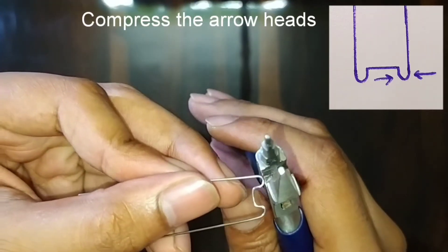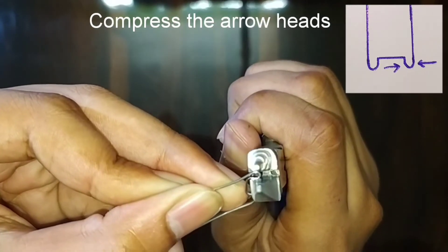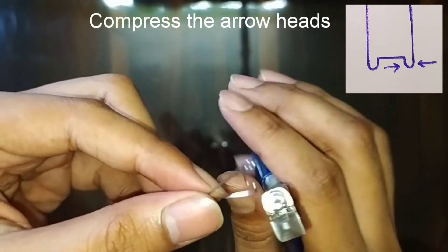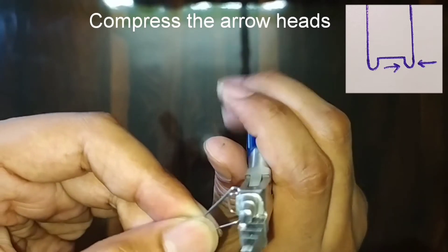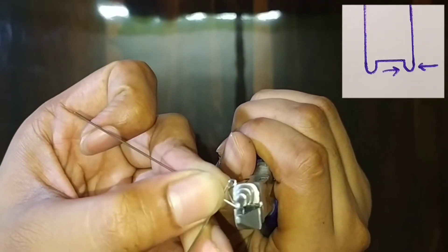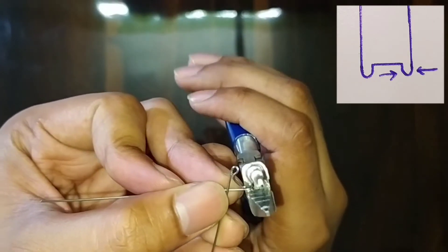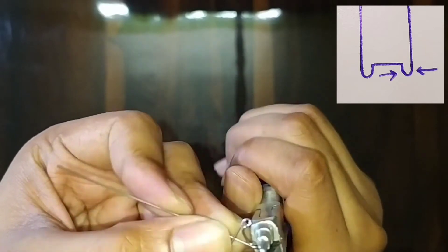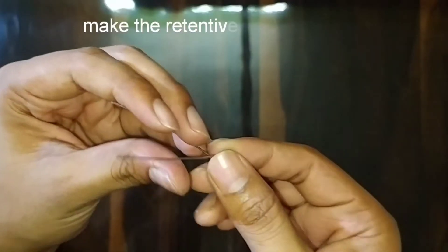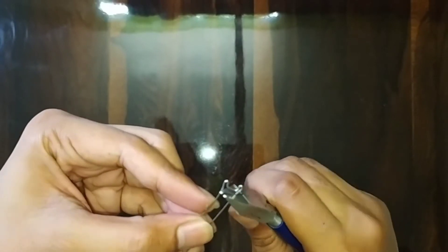After this, we will compress the arrowheads with the help of the plier — try to make it as narrow as possible. Then I am making the arm straight again so that it will be easier for the further procedure.